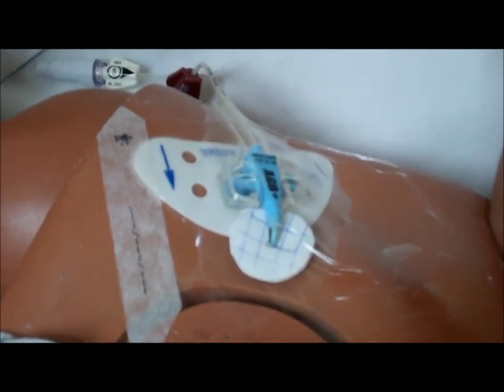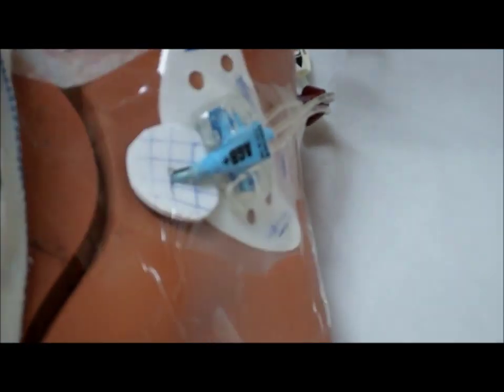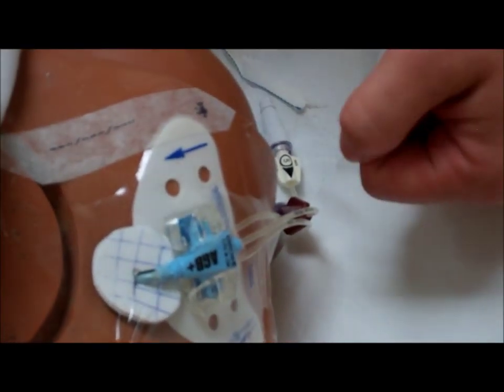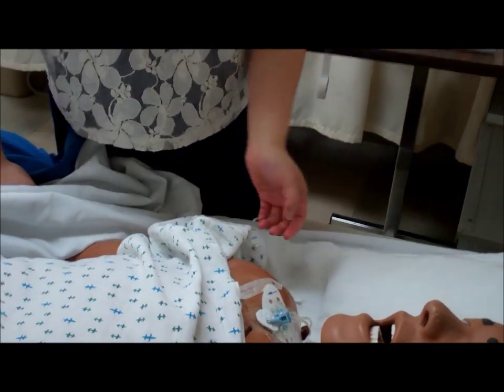And with the PICC line, what we would do is measure the catheter, from the port to the proximal tip, to make sure that it's still the same length that it was before. There are other alternative dressings, such as sterile gauze, and that's used if maybe there's a lot of oozing blood, and that would be changed every 48 hours.